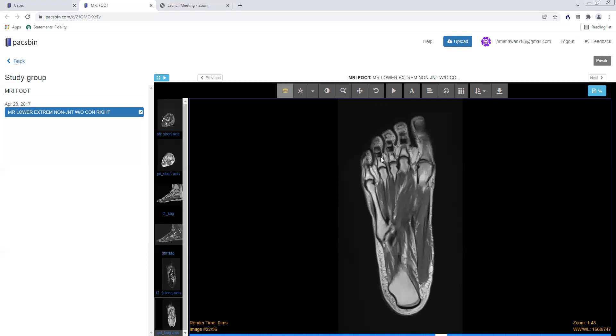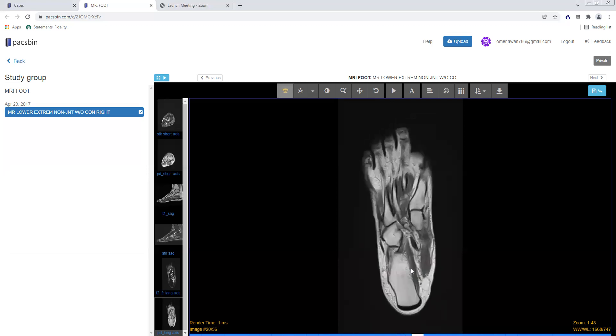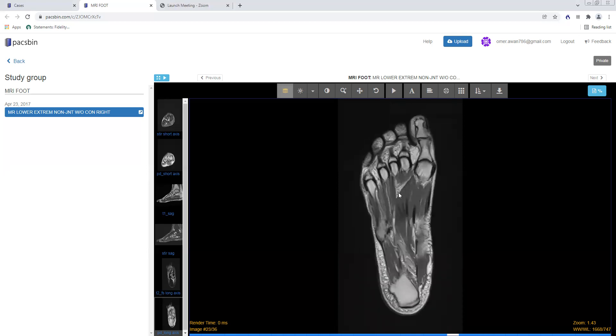The long axis axials give you a nice gestalt of the entire foot. You can see the first distal phalanx, proximal phalanx, and first metatarsal, and the same for the second, third, fourth, and fifth digits. You can look for any hypointense line to suggest a fracture. Here is the medial, middle, and lateral cuneiforms, the cuboid, navicular, talar head, and calcaneus. You can see the alignment at the TMT joints, look at the Lisfranc ligament on T2 fat sat, and check the muscles to make sure there's no T1 hyperintensity to suggest atrophy.